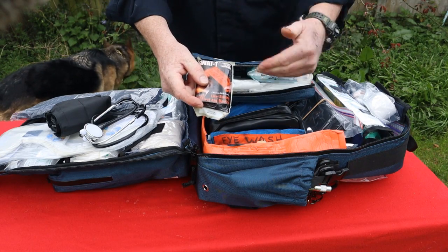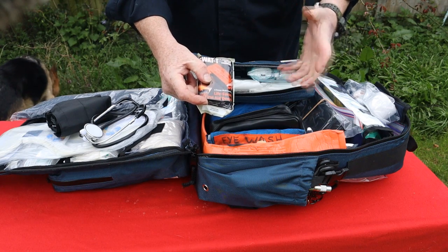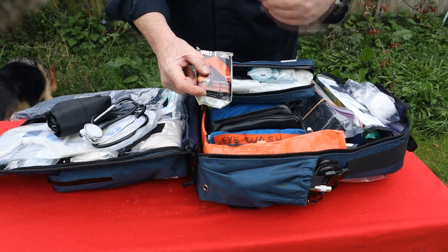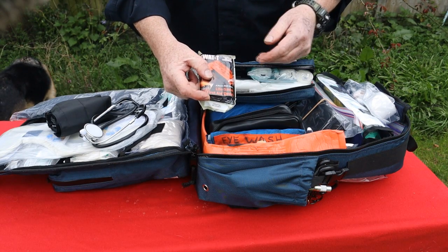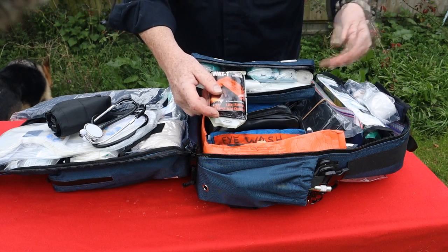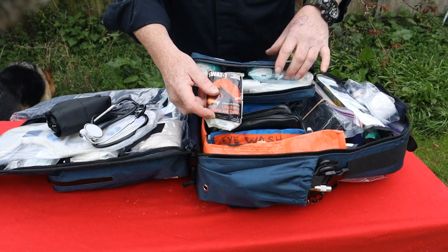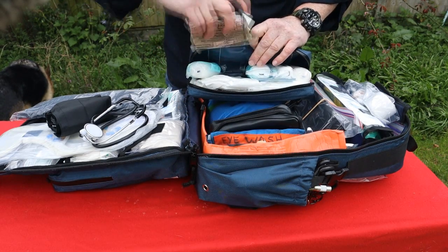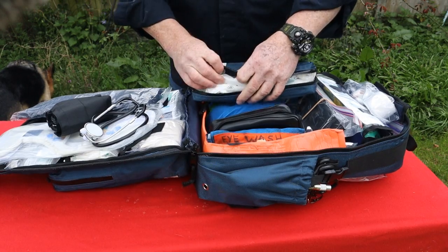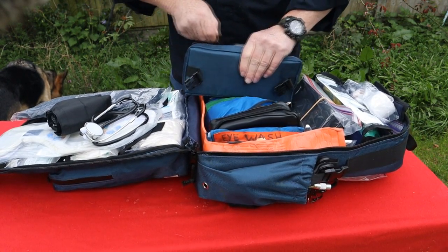So if we put this on a little bit looser, it can get direct pressure over a wound, yet the limb is still being perfused, as opposed to the need for a complete tourniquet. But if you need a tourniquet, you can just put this on a bit tighter, you know. So I'll drop some pictures in about the SWAT-T. You'll see what that is, and that goes in my extensive blood loss part of the kit. So again, we're still all basic life support.